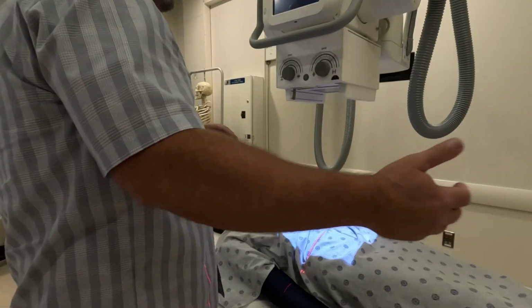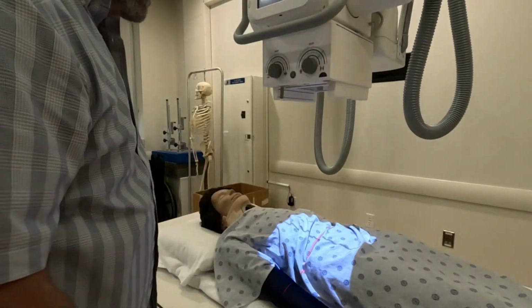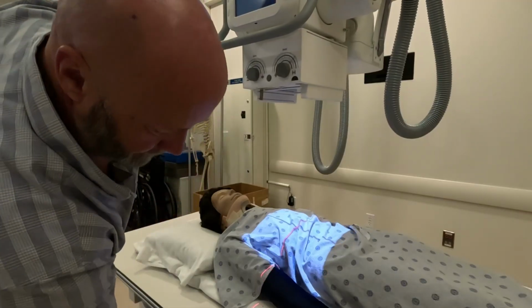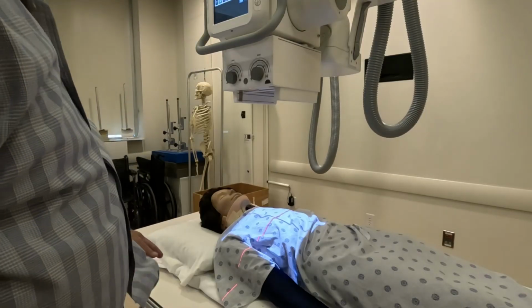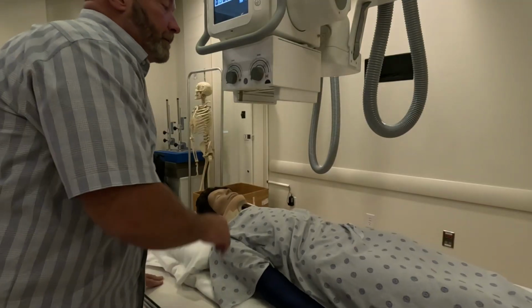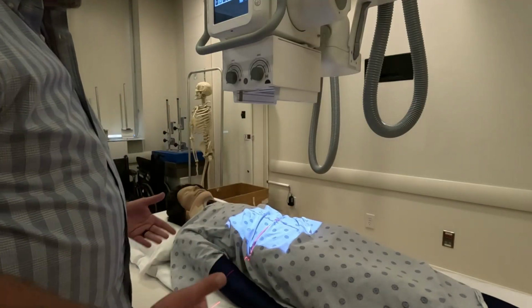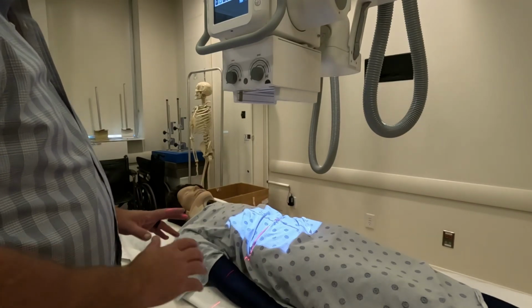Get the patient on the table, move the tube over the patient, lock in transversely, lock in vertically, align to your image receptor, and then forget all of that exists. The only thing that exists at this point is the button on the floor so that you can move the patient, and that light button right there. So you move the patient around, put it at the iliac crest if we're shooting a KUB, kidneys, ureters, and bladder for an abdomen. And you should be good right there.